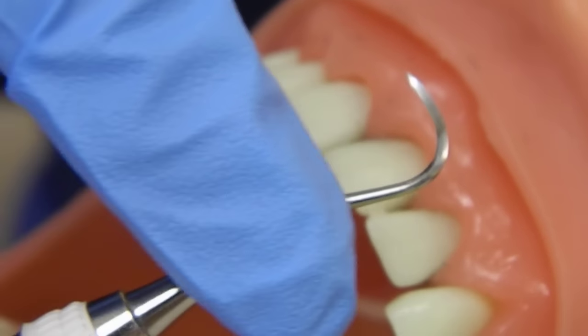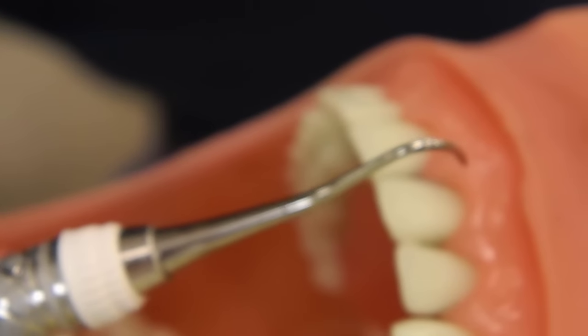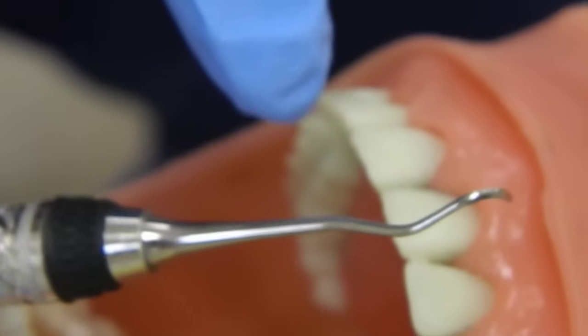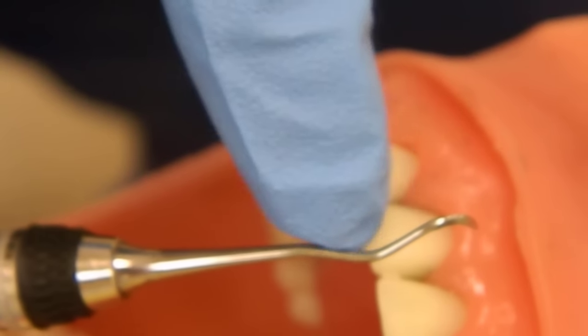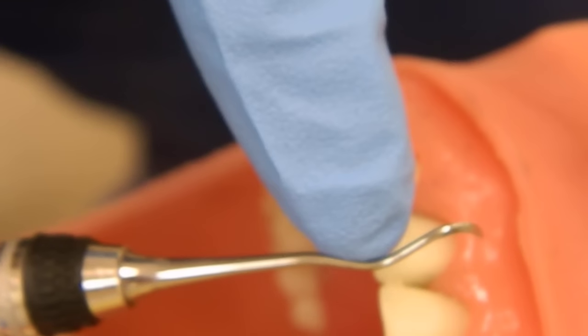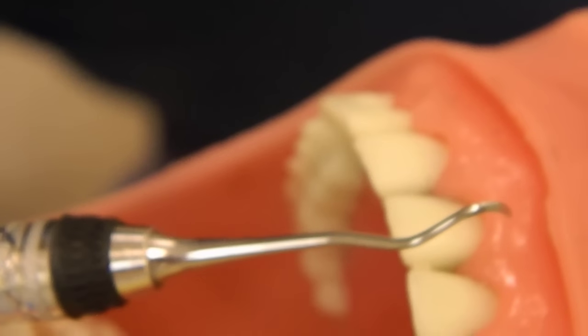The anterior sickle scaler is a simple shanked instrument — it has just one bend and a very straight shank. The other one is the posterior 204S instrument, and this has a complex shank with a functional shank, and then the terminal or last bend in the instrument — the terminal shank. So this is only for posterior.